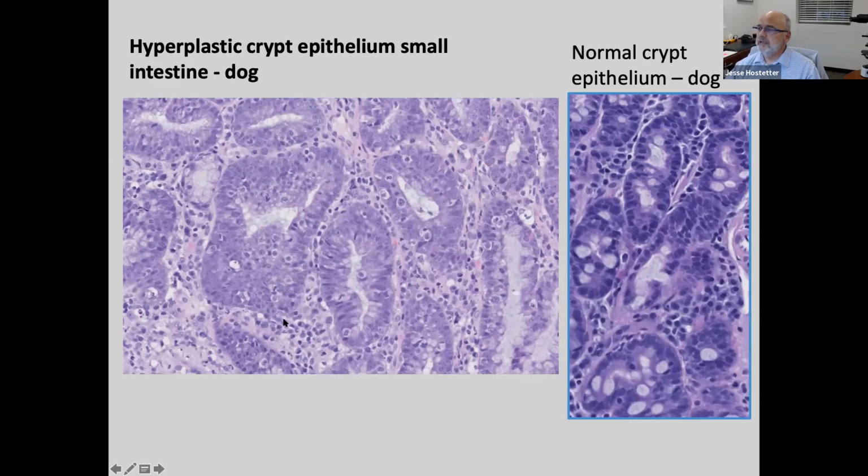This is inflamed intestine, and here you can see really a proliferation of the enterocytes, and they've lost a lot of their polarity. They're really crowded in there, one on top of another. Sometimes the luminal space is dilated as well.